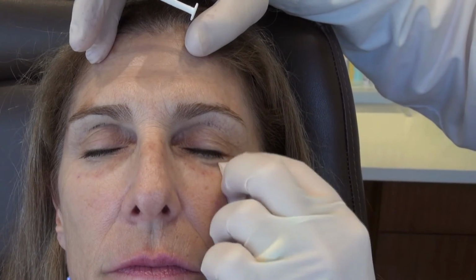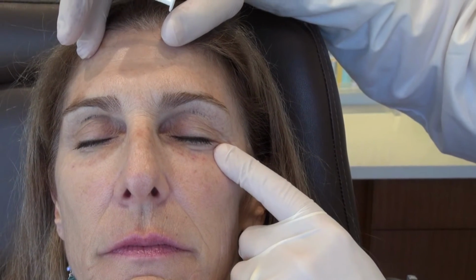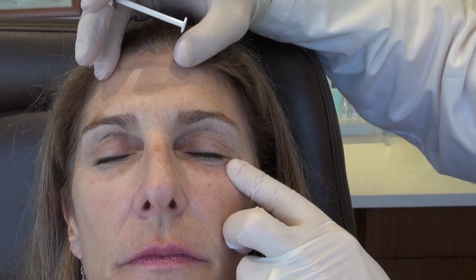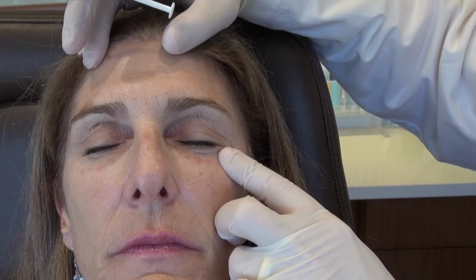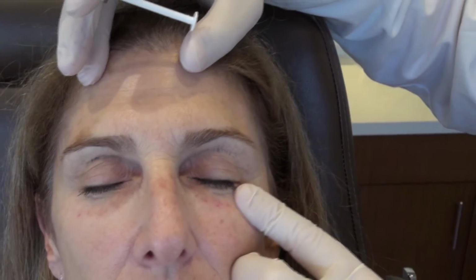So one morning it could be real puffy, one morning it would be not so puffy. So this is a way around that situation by pre-hydrating the Juvederm, so when it goes into the tissue, it's already got lots of water around it, so it doesn't absorb any water from the surrounding tissue, and it doesn't have that kind of swelling or bumpiness that we saw.